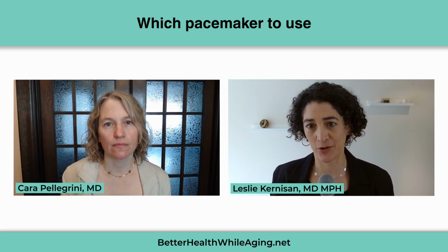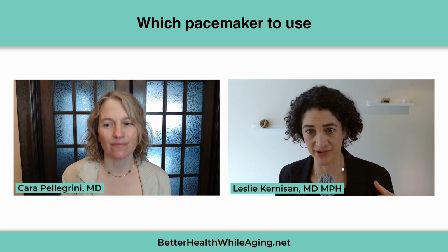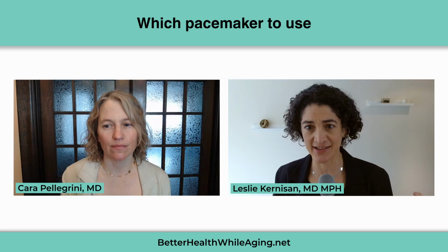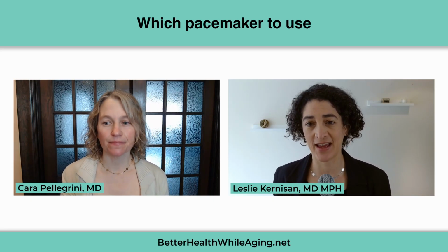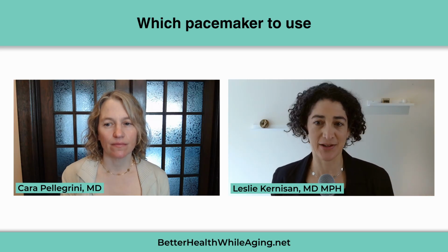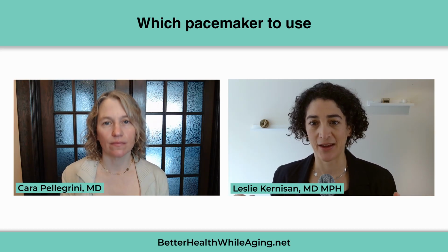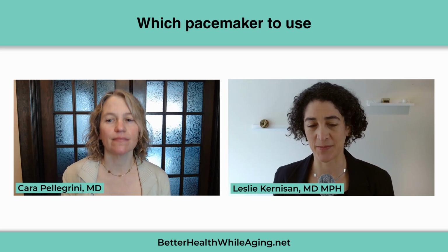And that's the basic pacemaker, although now they have, I guess, these newer ones that don't have the wires. The wires are what you call the leads, right? Exactly. And so now we have leadless pacemakers. And then there's a fancier device that is really for people with heart failure, a cardiac resynchronization device, I think is what you called it, or biventricular pacemaker. So you would use that more for heart failure.